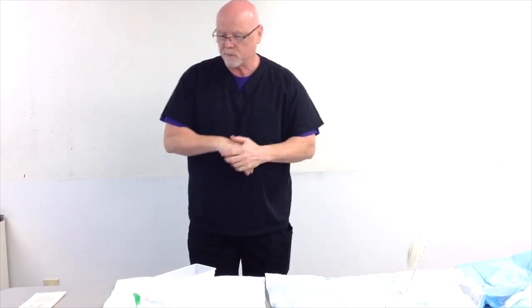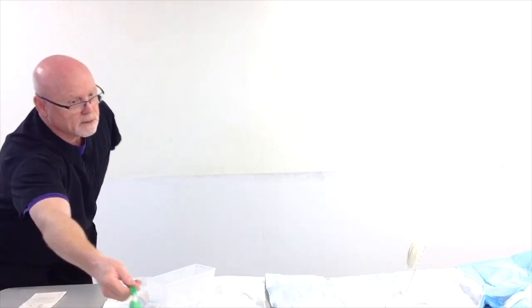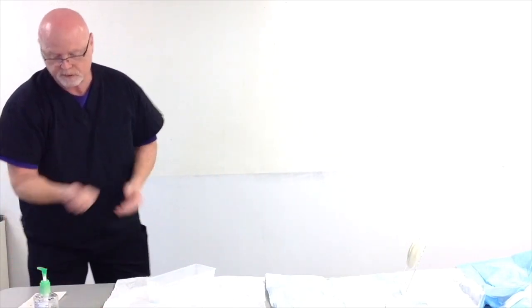Okay? Yes. I want to see some heads nodding. Okay, I got it. So, now that we've got this set up, if I wanted to get another shot of gel, I could. I could bring this right over here, get myself another shot of gel.